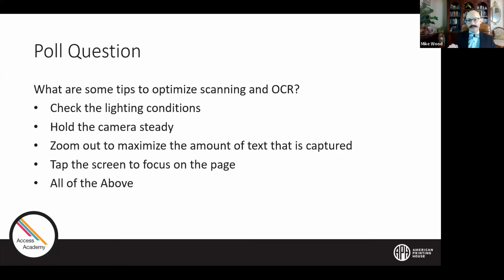So if you need to fill out documents, you can do so with the Juno, but the Ruby 10 does give you more space on the right-hand side. So they are very similar, manufactured by the same company. I feel like the Juno was released before the Ruby 10, and a lot of the functionality that Justine and the folks at APH wanted in the Juno then transferred over to the Ruby 10 when we released it. So yeah, great question, Dorothy. They are very similar.